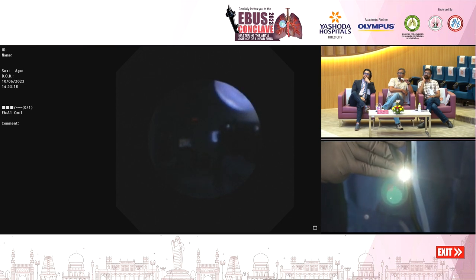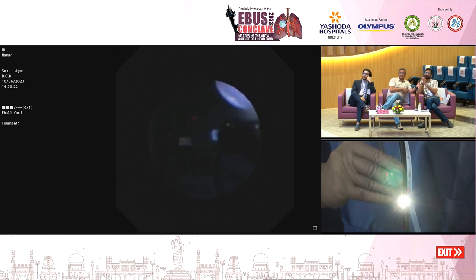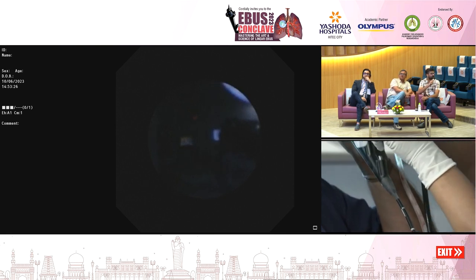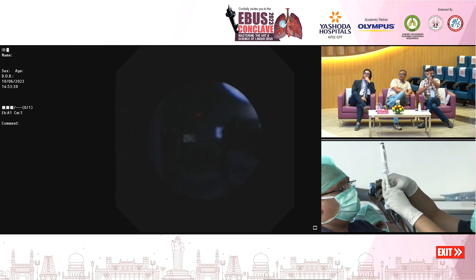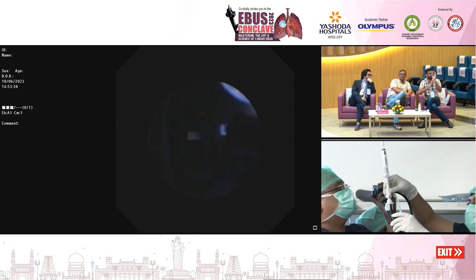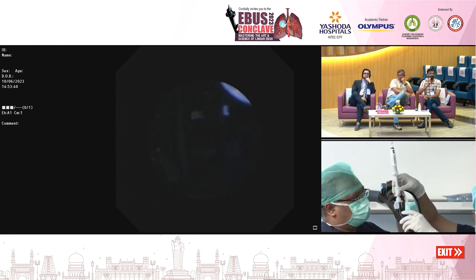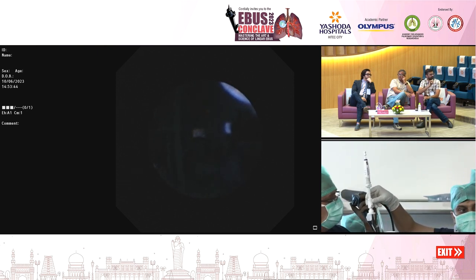And we have to adjust it so it is just slightly visible in the top right corner. As we can see in the endoscopic ultrasound, it is in the top right corner at the 1 o'clock, 2 o'clock position. The sheath should be just seen. This indicates that the sheath has come out of the working channel and it is safe to bring the needle out and it is unlikely to damage the scope. We should be careful about this step, and missing this step could be quite costly.